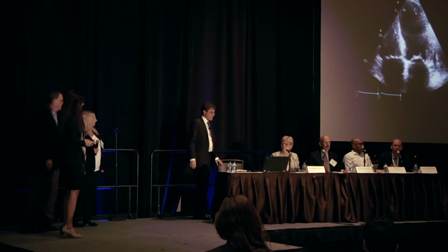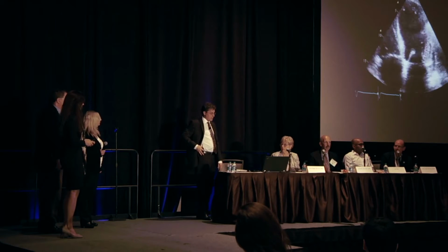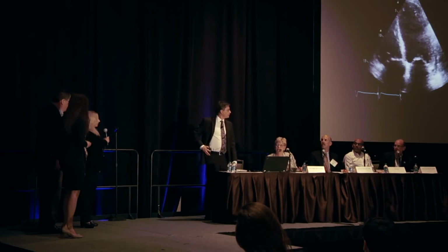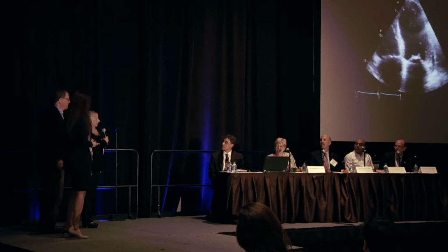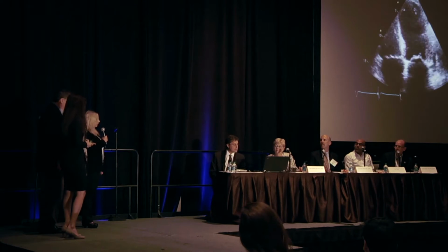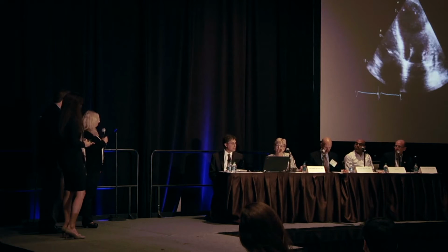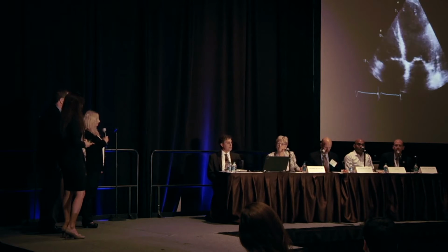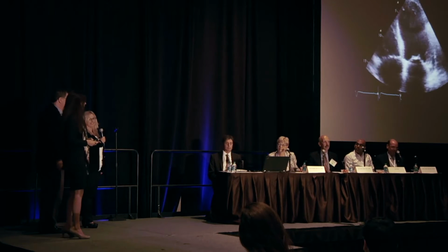What is the average time to assess left ventricular function with the system? It is about 10 milliseconds per frame, so typically about 1 to 2 seconds. Thank you. As I said in the presentation, very fast.